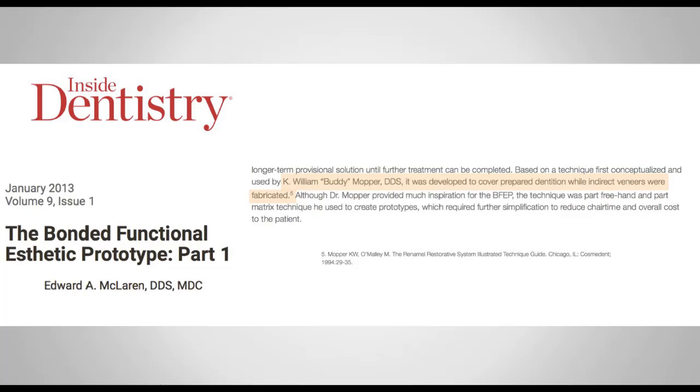The idea was that he had to develop a technique to fabricate temporaries for porcelain veneer preparations. As all clinicians know, fabricating temporaries for veneer preparations is very difficult, because there's really little tooth structure removed, and we can't bond them permanently because we're going to need to remove them anyway.